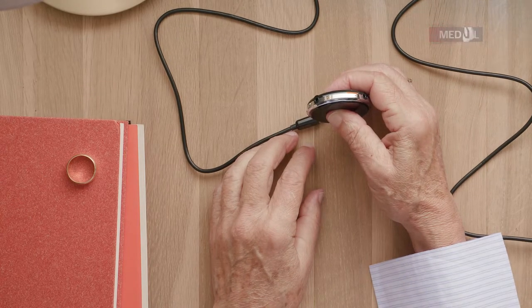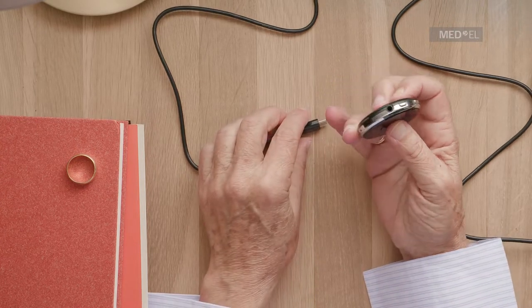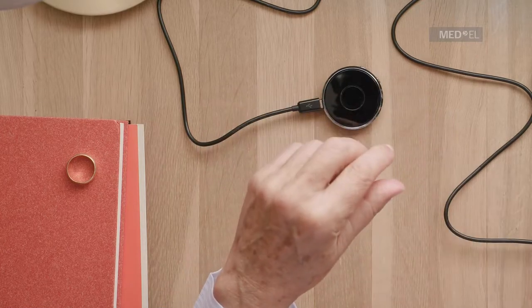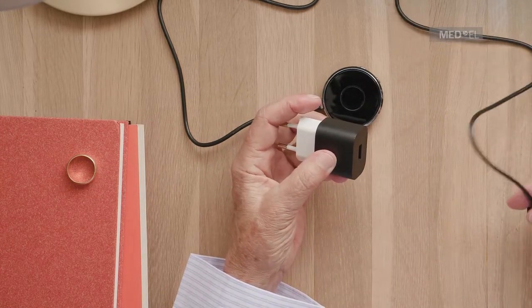If Samba2Go has a flashing orange LED light that lasts for 5 seconds or more, its battery is low and needs to be charged. Plug the USB cable into the USB port, plug the other end into the power adapter, and then into a power supply.